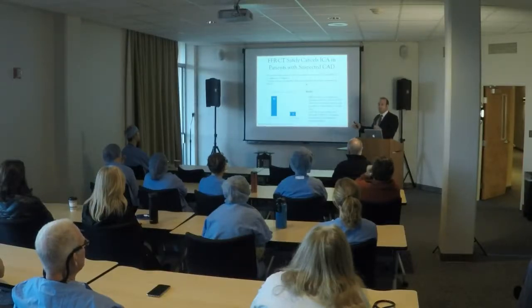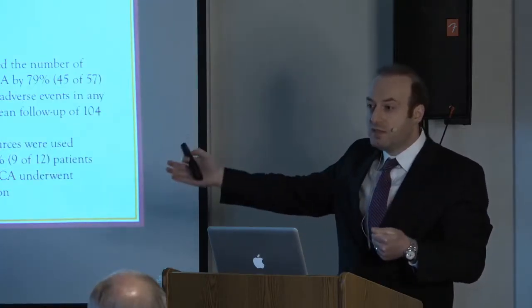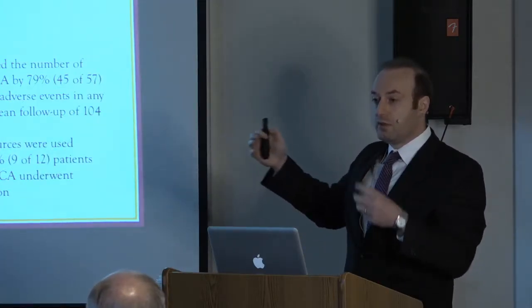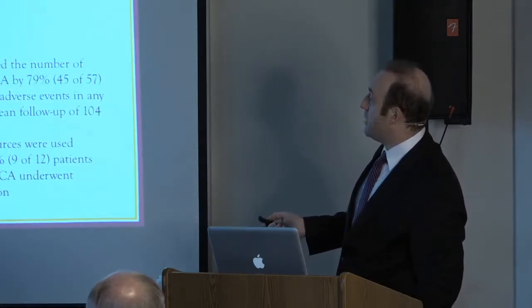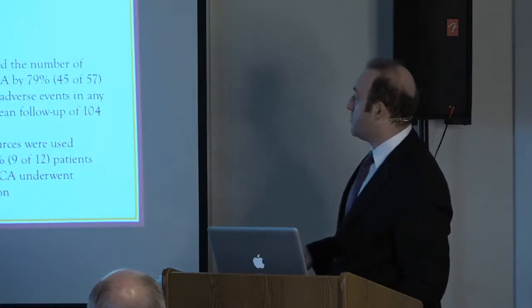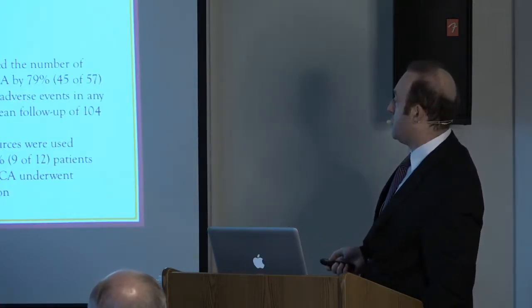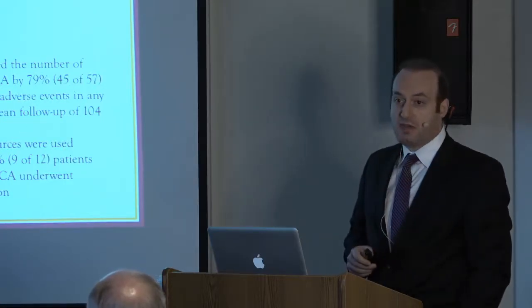If the CTA is clean, we talked about the negative predictive value, we talked about the warranty period, you don't really need the FFRCT, but it's only in those intermediate lesions. So 57 patients had intermediate stenosis that required evaluation with FFRCT, and you can see the reduction in invasive coronary angiograms. And there were no adverse events in any of the patients whose caths were canceled.